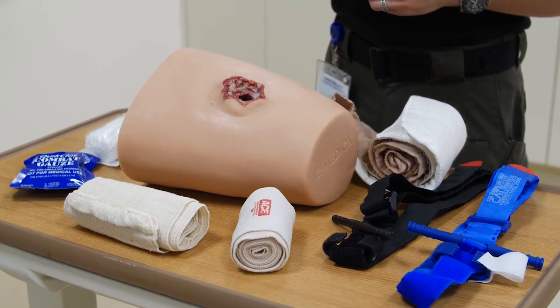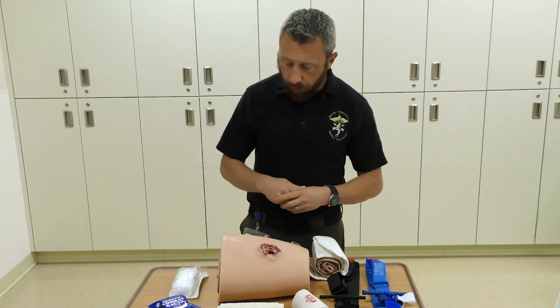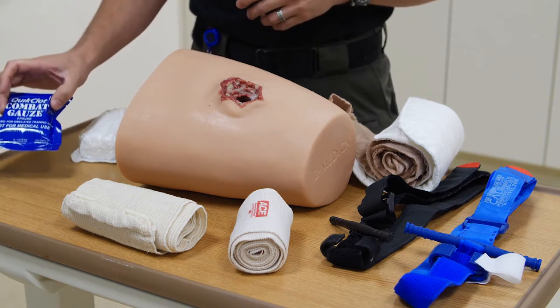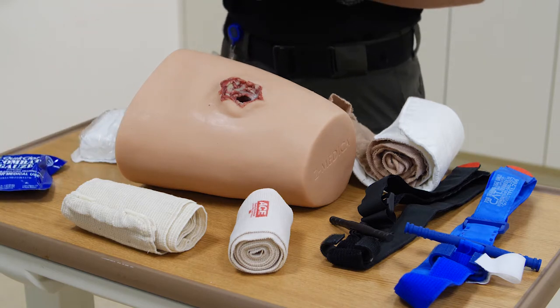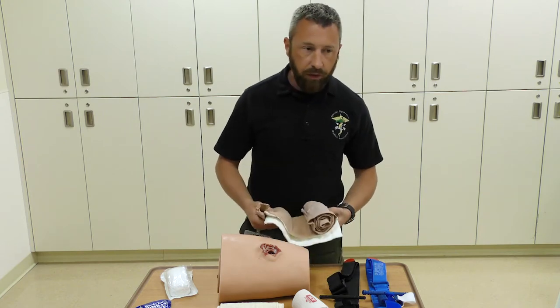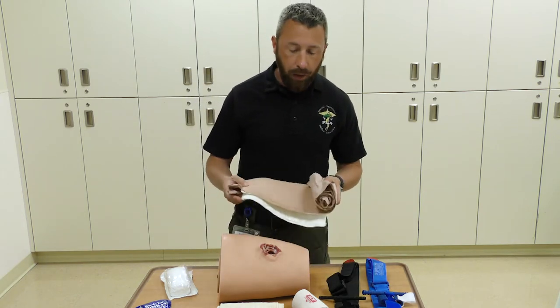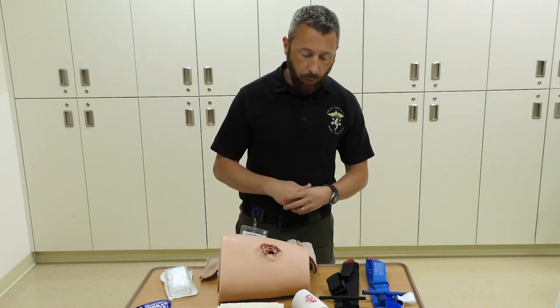Today we're going to cover wound packing, and we'll be using a wound packing trainer. Two products we're going to show are standard rolled gauze and a hemostatic agent — Zmedica's QuickClot Combat Gauze — a product carried in the field by both law enforcement and the military. The other product for wound packing would be some sort of pressure dressing, either an ACE bandage or an ACE bandage with a pad sewn on it, which becomes an emergency trauma dressing.